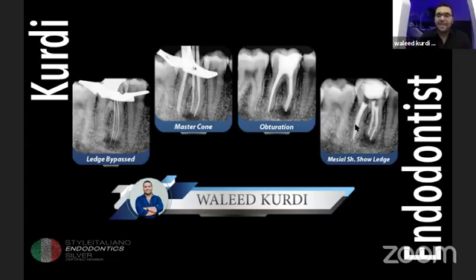And then I used the rotary file in a normal rotary motion. As I told you, after 25.02 manually hand file, I went to 20.04. And in this part, I used the TCA technique. If you know the tactile control activation or the TCA technique, here I put the file until the flutes are fully engaged inside the canal, then I activate.